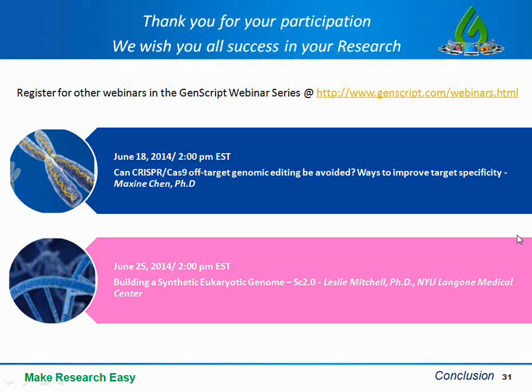One question is, is there any advantage to using L929 conditioned media over MCSF specific for macrophage differentiation? That's a good question. As I talked about, there are two methods to differentiate macrophages: using the L929 conditioned media or just using MCSF in your media. When I was culturing, I was using L929 conditioned media, and I didn't see any differences from people that were just using MCSF in their culture media.